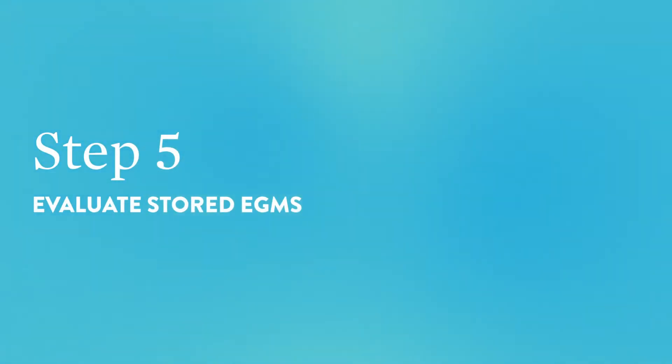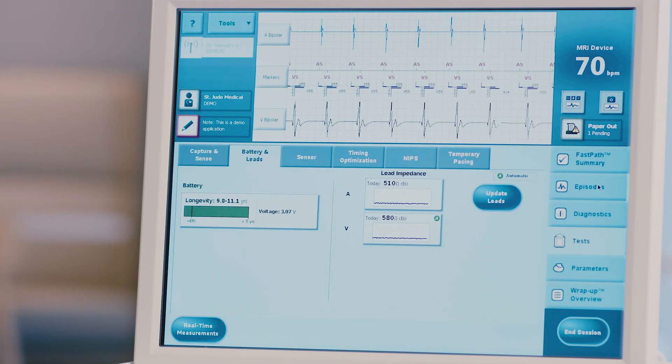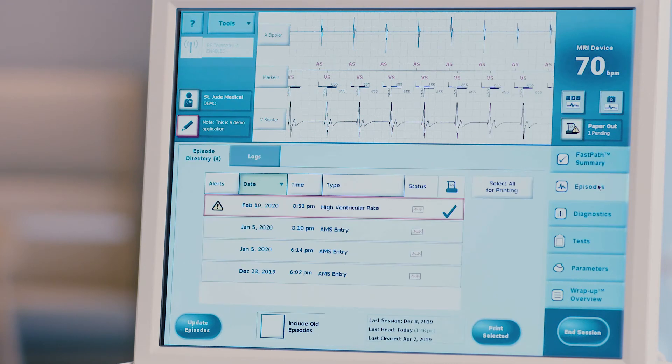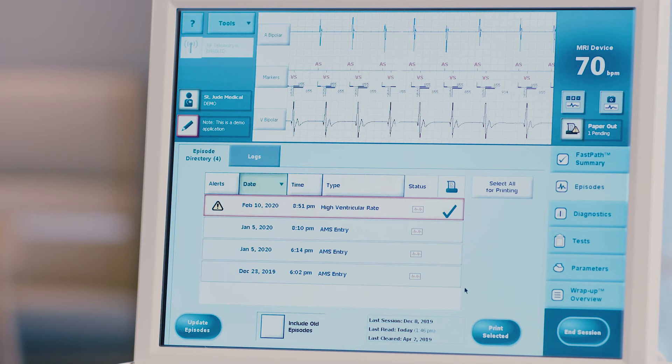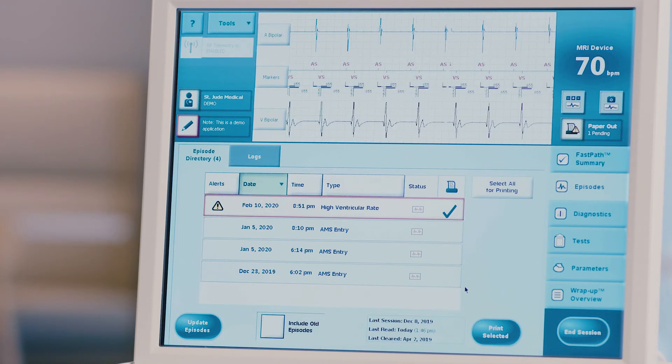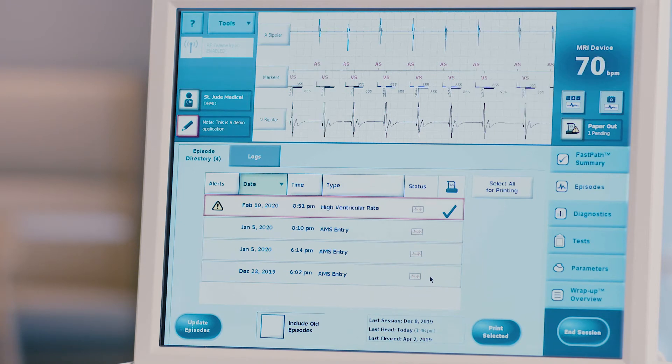Step 5: Evaluate stored EGMs. Press the episodes tab on the right hand side of the screen to open a list of recorded episodes. The episode directory screen will appear, listing all episodes recorded by the device since it was last cleared. Any episode that has an accompanying recorded EGM will be noted by this icon. Choose the episode to be evaluated by clicking on that episode in the list.